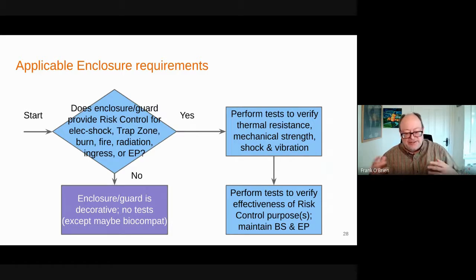And maybe shock and vibration, although that's generally not required, other than subtly. You have to have fixing of components in 8.10, but there's no test specified. And then you would do these tests, these mean and hateful things to your enclosure, or demonstrate the thermal resistance. More probably you'd be sourcing materials that already have the thermal resistance you need. But in fact, there is a ball pressure test that we might do. And then in addition to those mean and hateful things, you're checking that integrity has been maintained, in the sense of, have we maintained basic safety and essential performance?